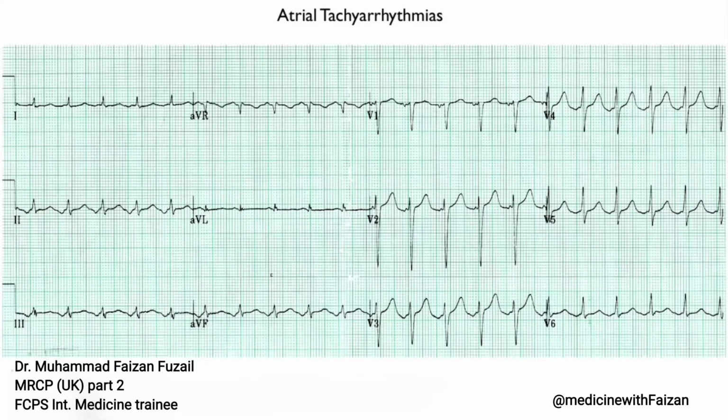When you scan across, you can see that the QRS complexes appear to be quite regular, and if you look for a QRS that lands on a solid line, you can count off 300, 150. It's about maybe 120 something. But remember the trick, look for two QRS complexes and count from that. So here's one and here's another. And those are exactly, let's see, 300, 150, 100, 75, 60. So if you count 60 beats per minute for 2 beats, then 1 beat has to be 120 beats per minute.